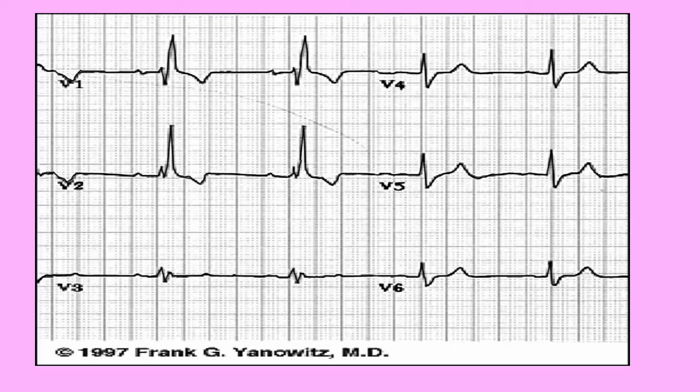And that's the common or normal EKG. But so far, we've seen 6 examples where the R wave can actually be taller than the S wave in V1. It's a good thing to be thinking about as far as the cumulative nature of the course. So again, the R wave should be smaller than the S wave in V1. It can be taller than the S wave. The first case that we looked at was counterclockwise rotation, which could give you an R wave that's taller than the S wave.